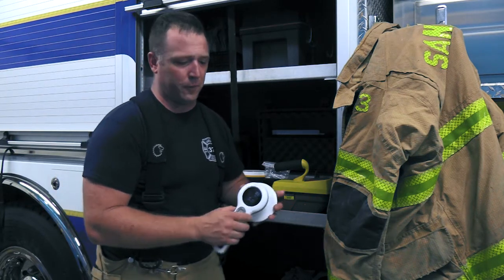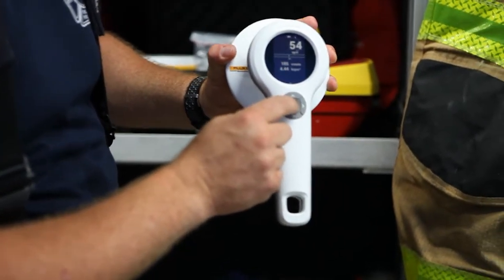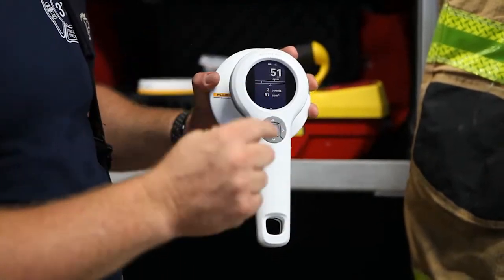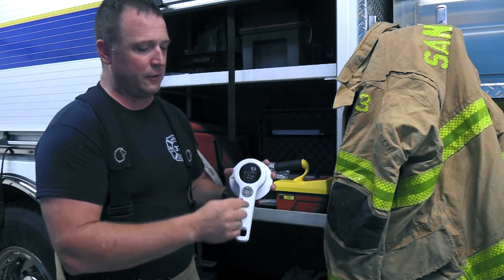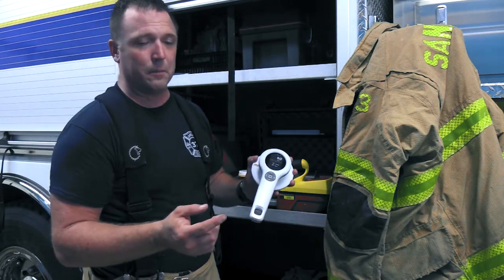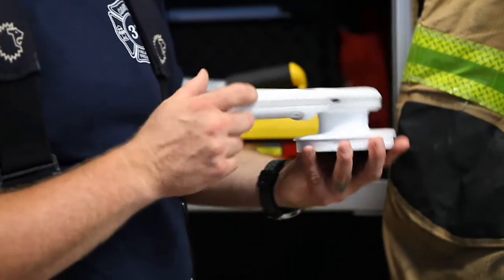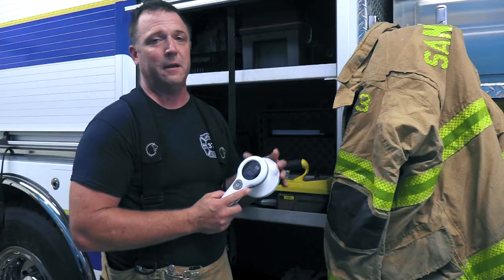Another nice feature about the 452 is, after I've taken those energy readings, I can simply push the center button and zero out the accumulated dose. That's going to also save everything that's happened in this device, so I can either use the menu to go back and retrieve those settings and that information, or I can plug in using the RaySafeView software and a standard USB to micro USB cable and retrieve the data off of this device at a later time.